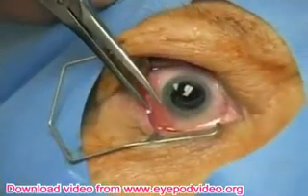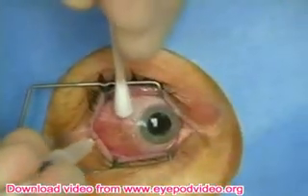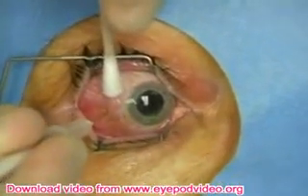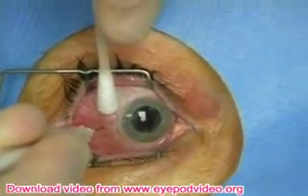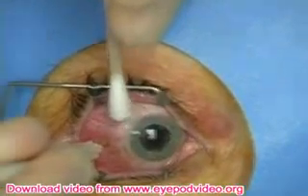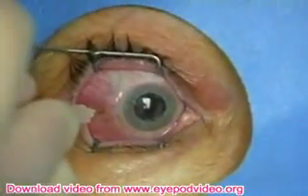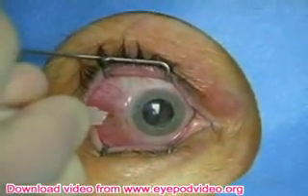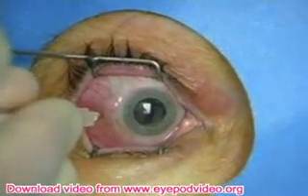I measure with my calipers. I then stabilize the eye with a Q-tip and inject intravitreally. Wait at least 2 or 3 minutes after the subconjunctival injection of xylocaine in order for the injection to be pain-free.